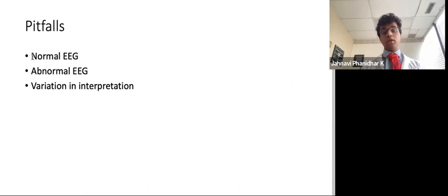The pitfalls are that a normal EEG doesn't always exclude epilepsy, and repeated EEGs or a long-term study like a 72-hour EEG might be required. Even then, we can't rule out a seizure disorder with EEG.